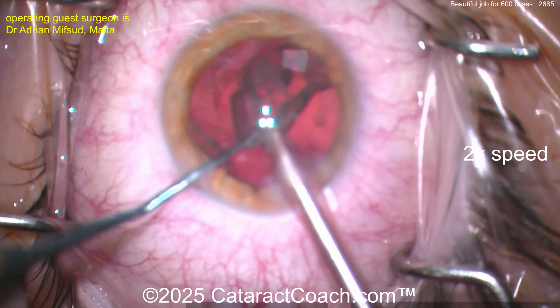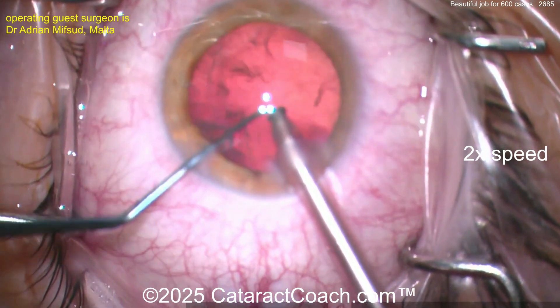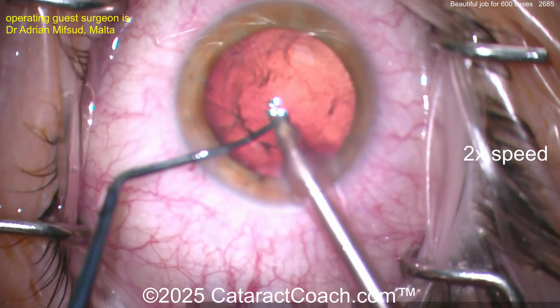It looks like a younger patient by those eyelashes and PSC category — maybe a 50-ish year old patient, which I consider young. Didn't always, but now that I've hit that mark, I think it's young.